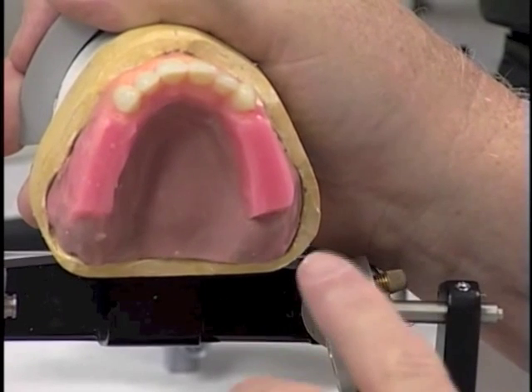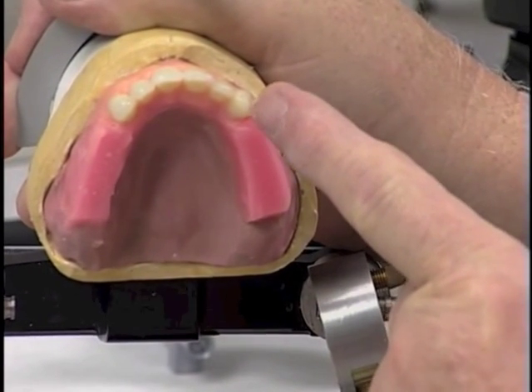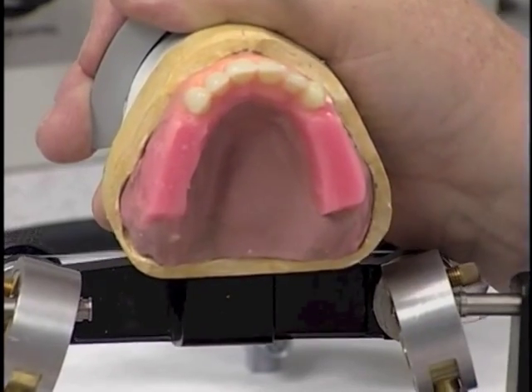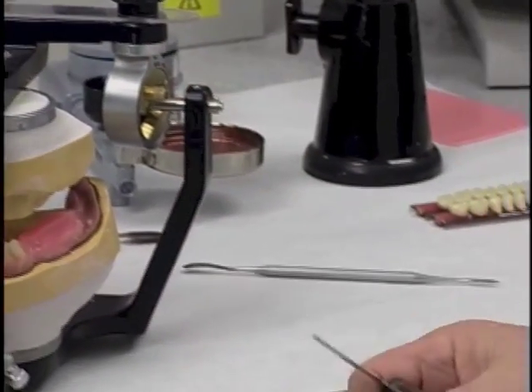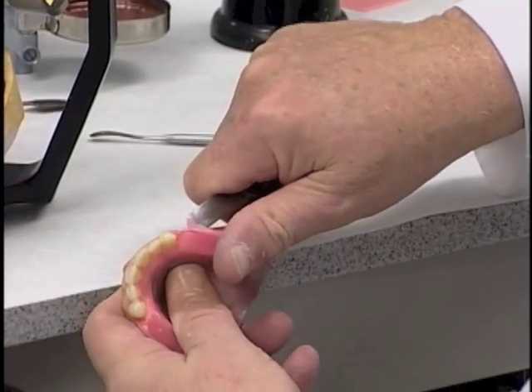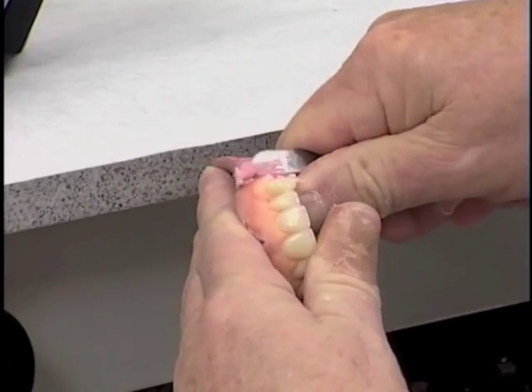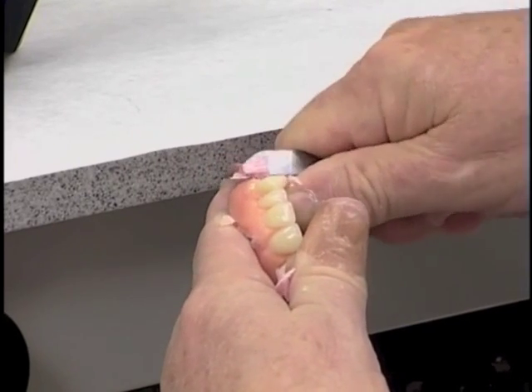when we have the posterior teeth in it, as they come along here, the buccal cusps are going to follow the arch form that we've started. So we're just going to remove some wax, enough to accommodate the two premolars in the maxillary left side.